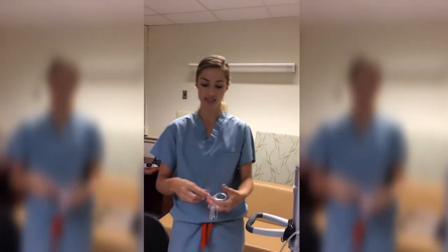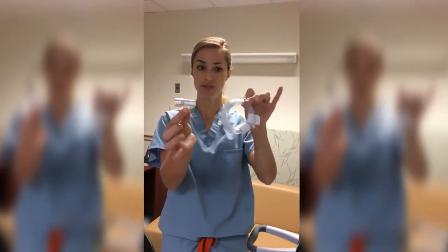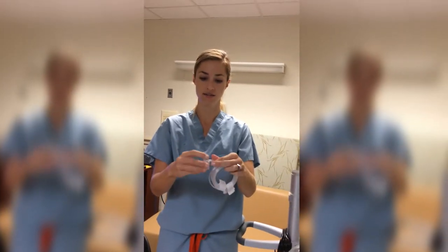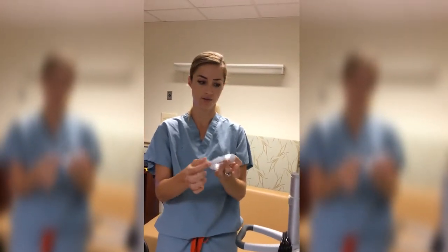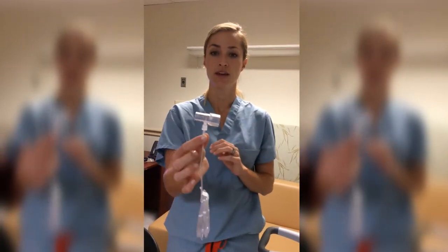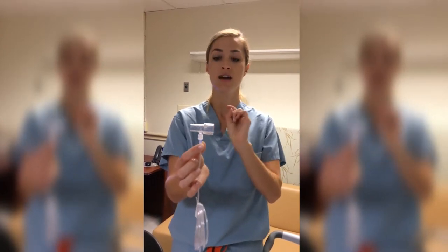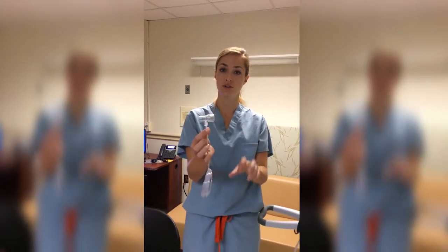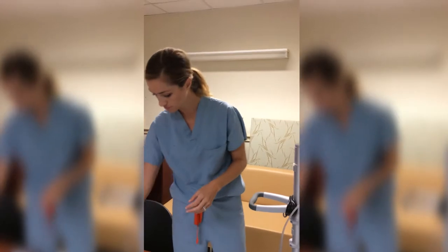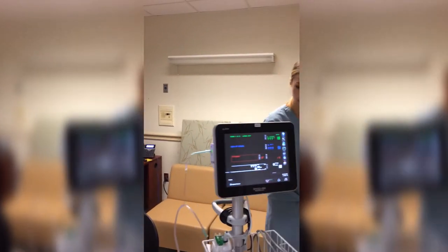The third option is the T-tube adapter, which comes in two packets: the T-tube adapter and the extender. It luer locks into the capnopod filter. This is to be used for patients that are intubated or trached. This product is only found in the ICUs. If you are in a non-ICU unit and need it for a trached patient, you can either call Central Supply or ask the ICU to send it to you.